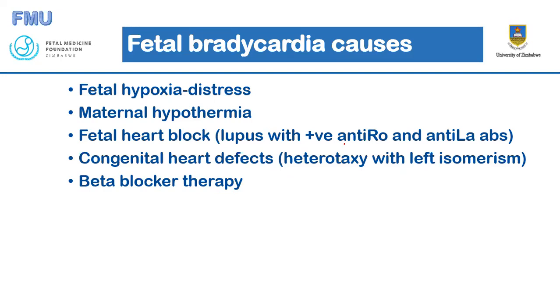More so in the antenatal period, if you are doing an antepartum CTG and you pick up fetal bradycardia, then the woman will need a thorough evaluation, including assessment in the fetal medicine unit, so that babies are not delivered too early. We have followed up cases with fetal bradycardia due to other causes, not just hypoxia.